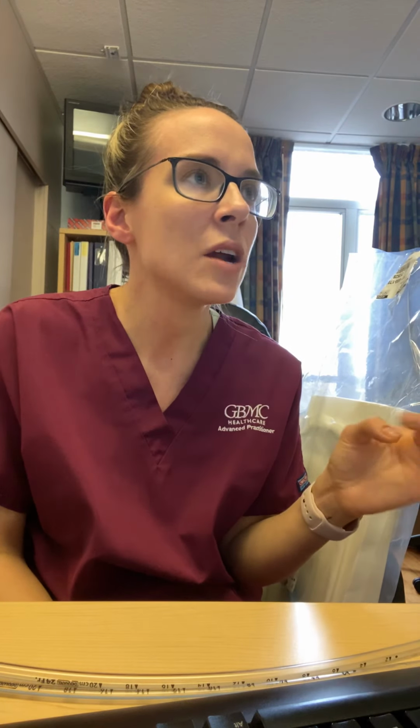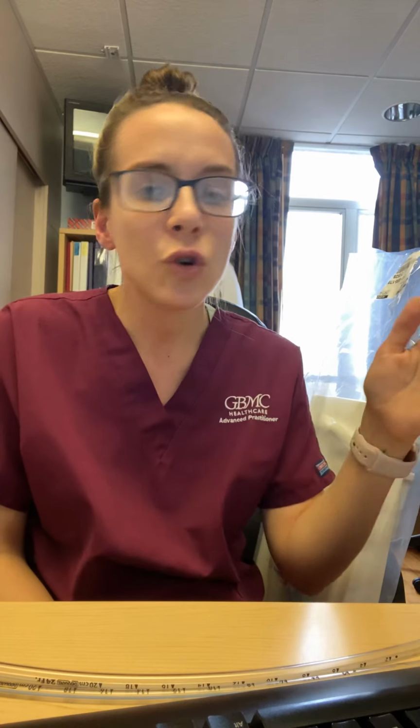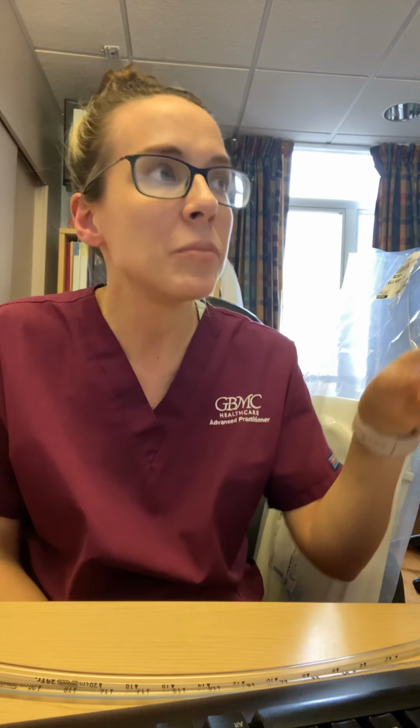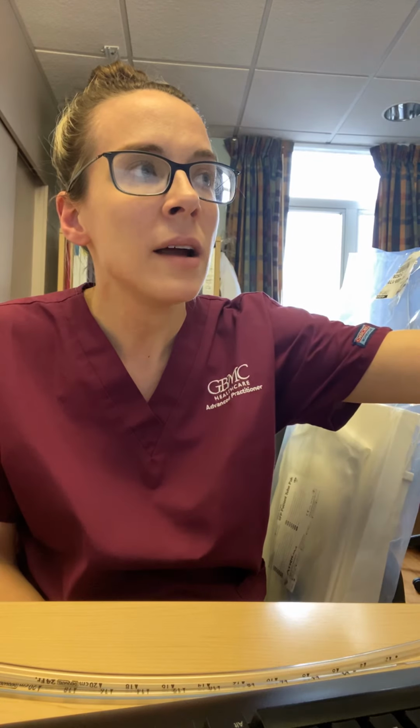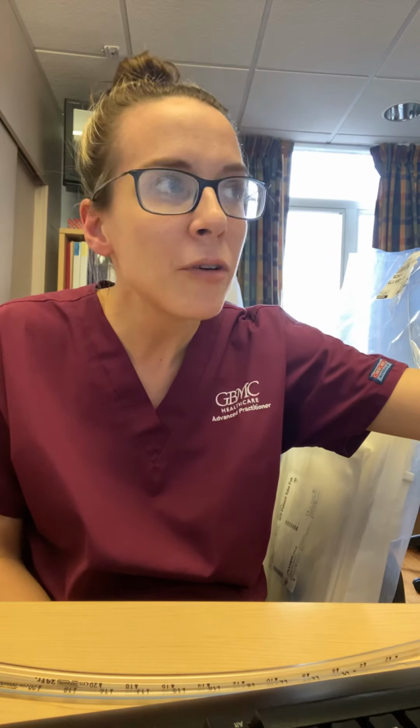So the suction in a wet suction drainage is controlled by the column of water. So where that blue arrow is pointing, I'm trying to show you that that column of water there is up to the 20 centimeter line. So the nurses would literally have to make sure that water is not evaporating out of there. It's always at the 20 centimeter line.